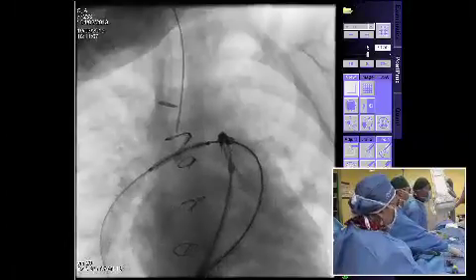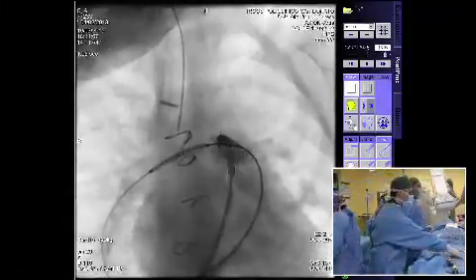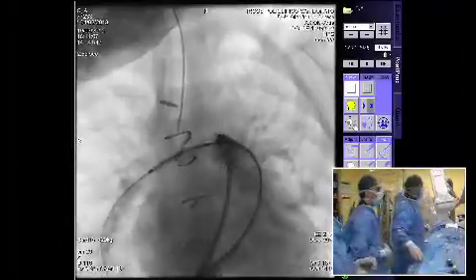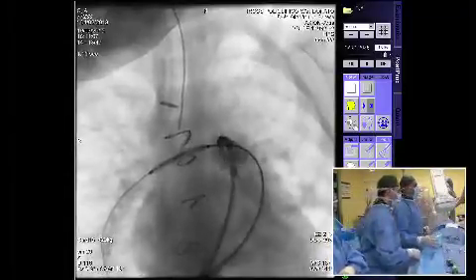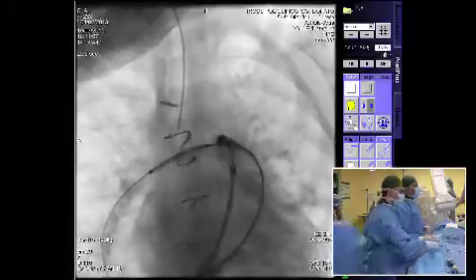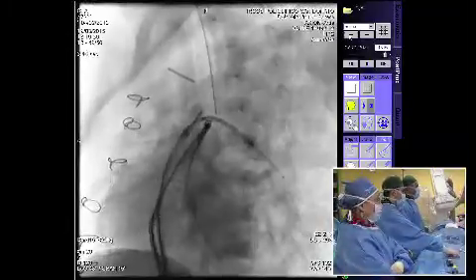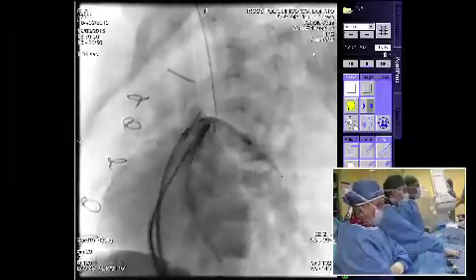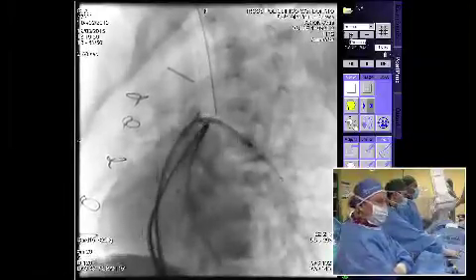Do you plan to put both stents at the same time or one after the other? Yeah, we should discuss about that. What about voting about that? I would do one after another, but I'm kind of out of practice. I would do one after another. And I would go first with the right. I would start with the right and have a look, and then do the left. Yeah, in this particular case, Gianfranco, this is Dr. Fontoneghi from Madrid. How are you?